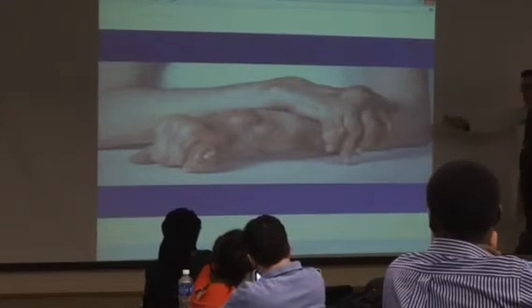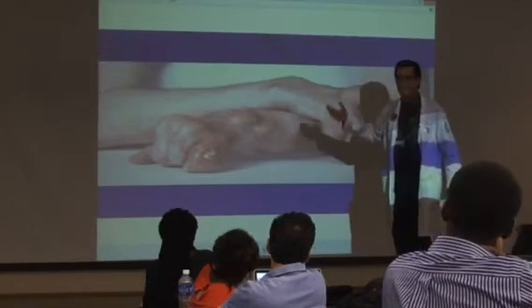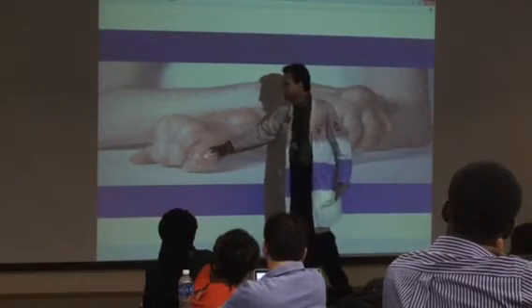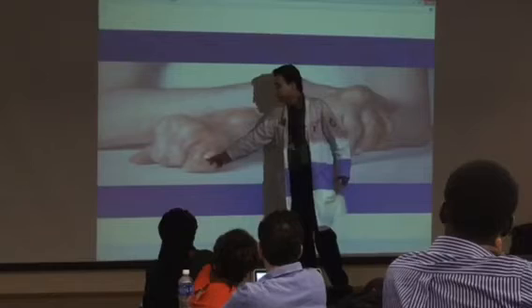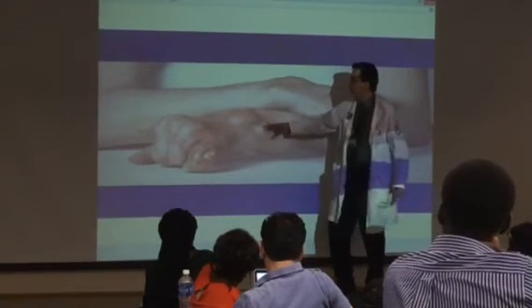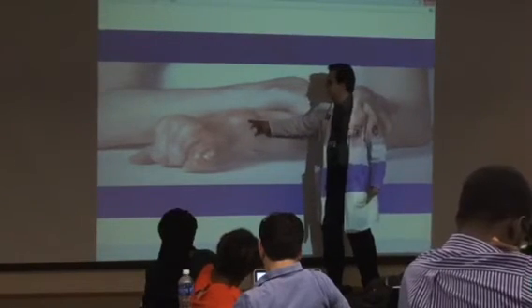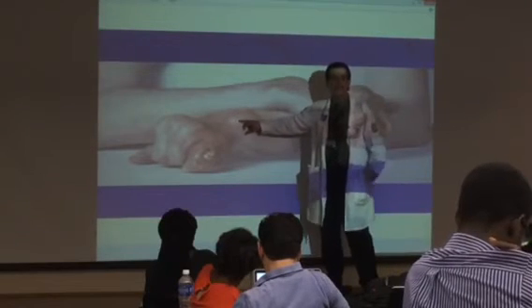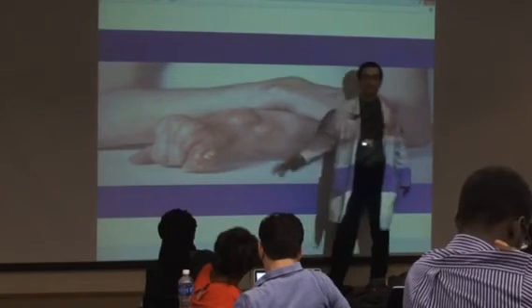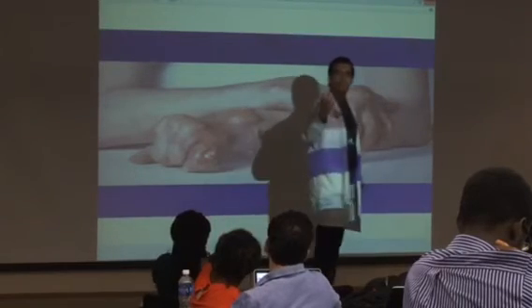Now, we don't see this anymore. This is somebody that never actually got the treatment. So usually it is confined to the joint, but you see not only the wall of the joint, those crystals, and you can see it actually is open up here, but sometimes, if you don't treat this hyperuricemia, the uric acid can deposit in the soft tissue around the joint too. And I want you to appreciate here, we call these tophi or gouty tophi. So you can see this is in soft tissue. Imagine a crystal, a foreign body, actually depositing in the soft tissue.